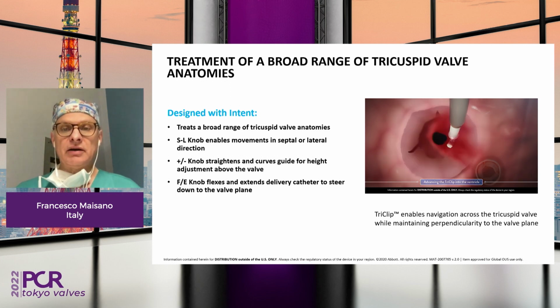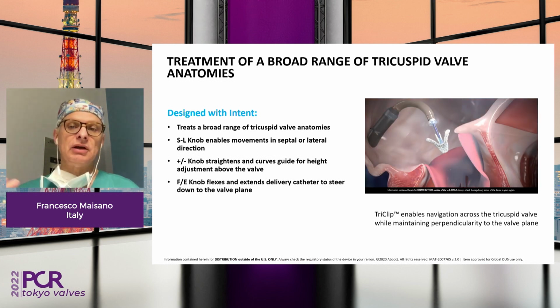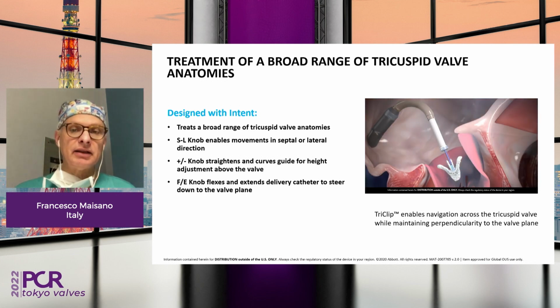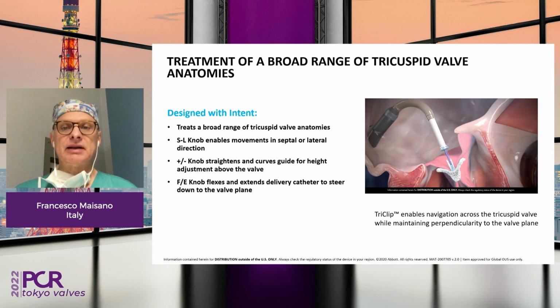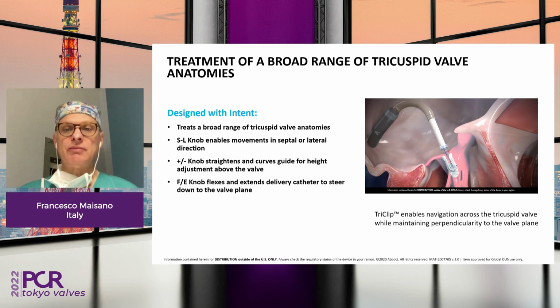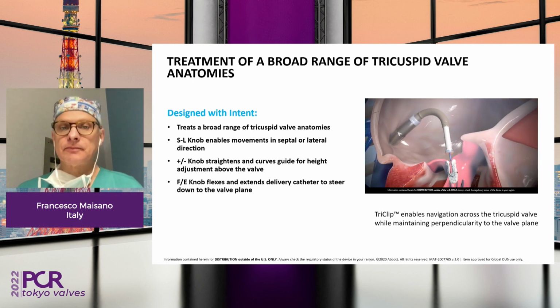but obviously in many patients today, we are performing clip implantation both in the anteroseptal and in the posteroseptal position, in the so-called clover approach, because in this way you obtain much better outcomes in terms of reduction of the TR, also not only because you are joining leaflets, but also because you have a much stronger effect on annular reduction.